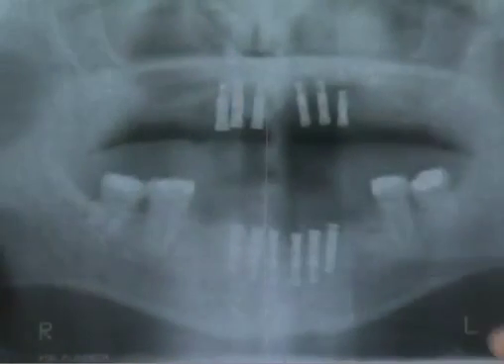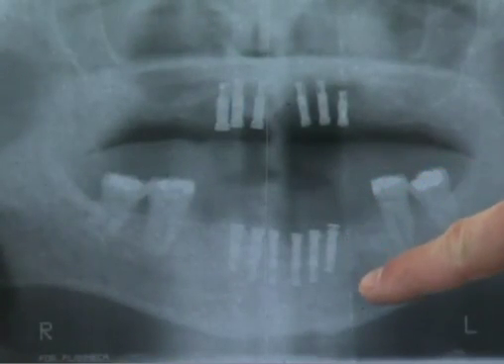You will be required to eat soft foods during the weeks following surgery to avoid excessive pressure on the healing sites. The 6 months following surgery are critical to successful healing of the implant. During this time, osseointegration takes place, where the jawbone grows tightly around the implant to hold it firmly in place. The osseointegration process is verified through clinical examinations and X-ray diagnosis.